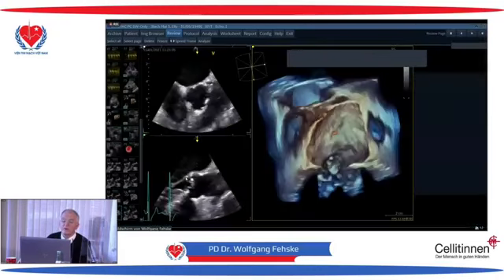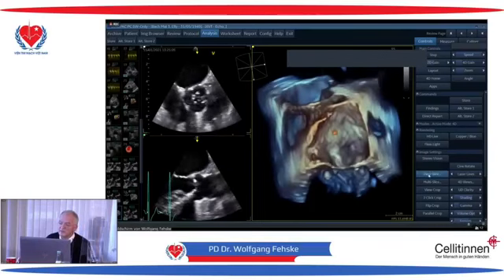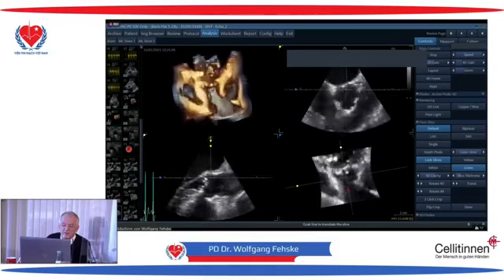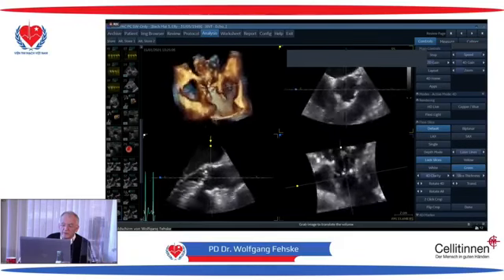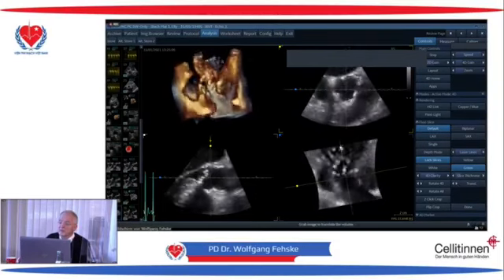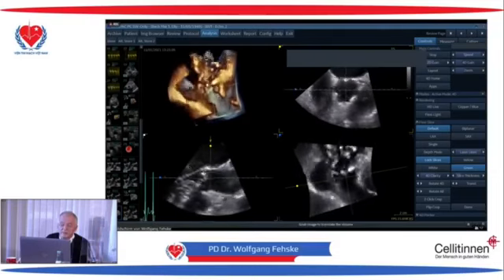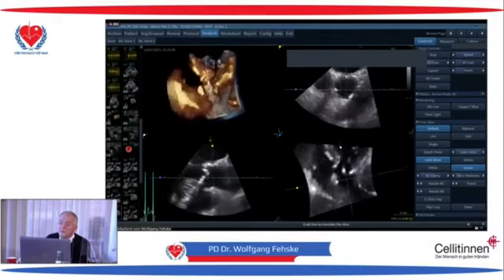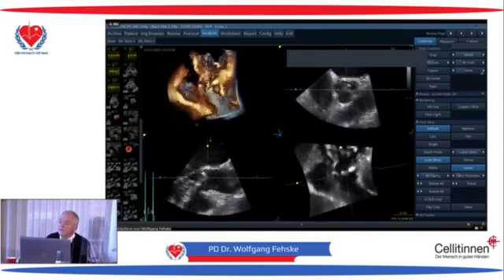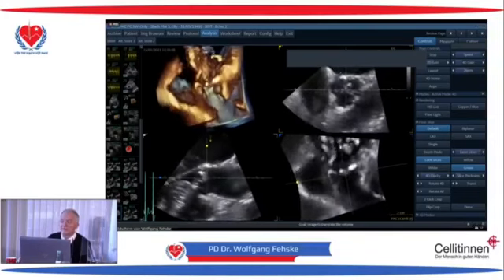So how we do it normally is that I take this here, and it's extremely fast. I take it down. This is a specific way that I have shown during my presentation today. You remember, I hope. And yes, you see now, this is exactly what I did before. I can do it now. This will be exactly the same result.